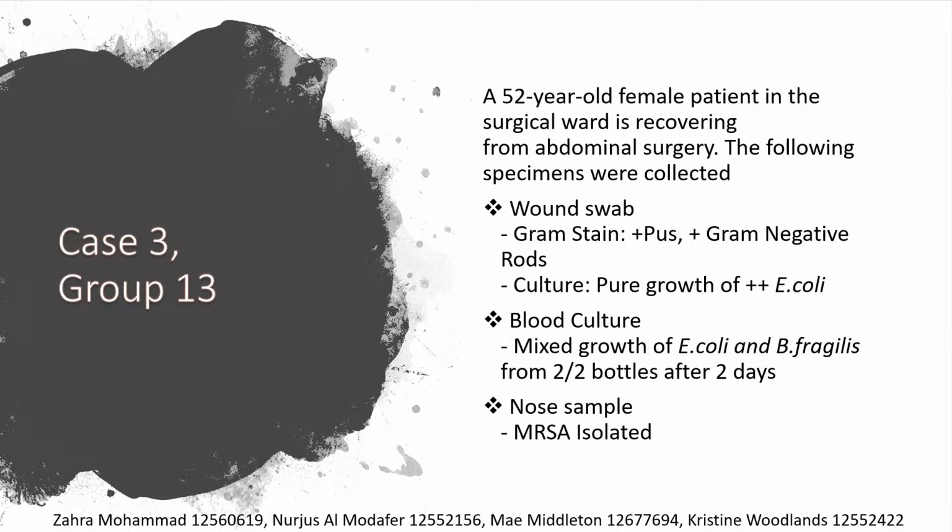The wound swab produced a gram-negative rod when the pus was tested and produced a pure culture of E. coli. After the blood sample was incubated for 2 days, a mixed growth of E. coli and B. fragilis was produced. With the nose swab, we were able to isolate methicillin-resistant Staphylococcus aureus.